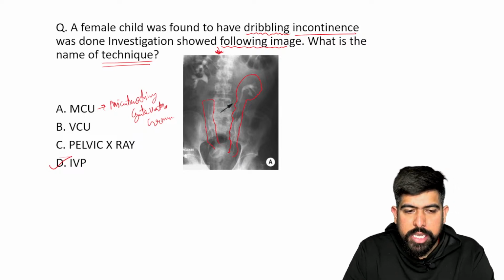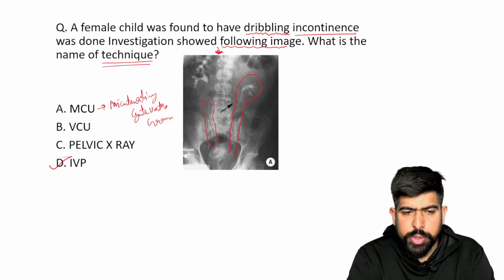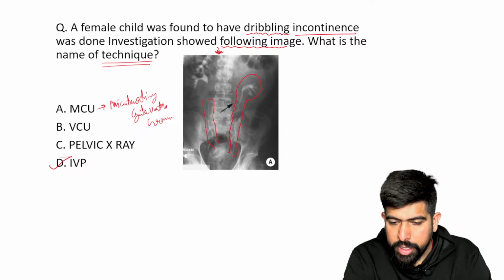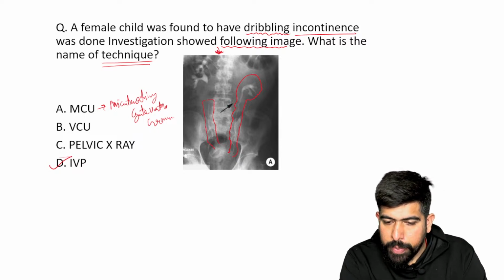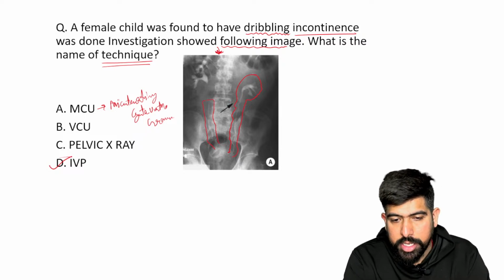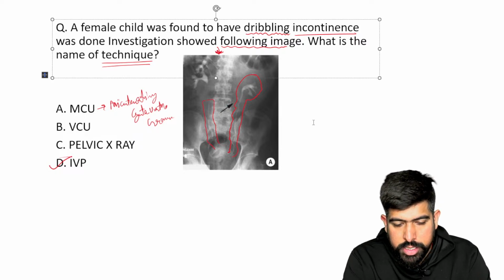If you want to see, I can show you the MCU images also. Just give me a minute. I think, is it clear to you now? MCU one, I am clarifying this patient's history. There may be bladder pathologies. Maybe bladder cancer is there or a bladder stone. I can show you the MCU image also. I'm putting it here. Just a minute.